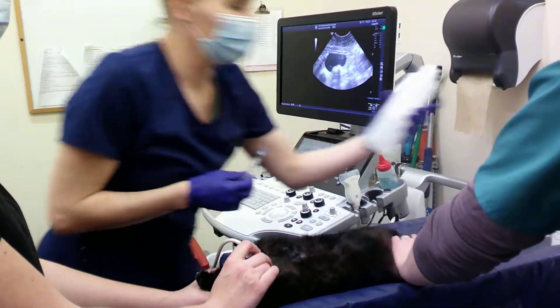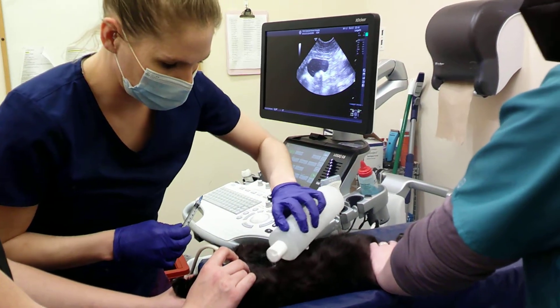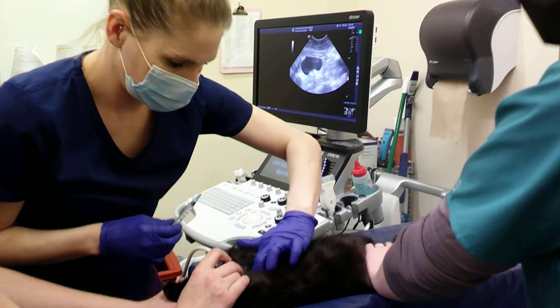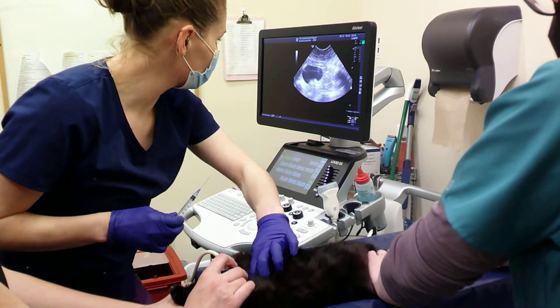22? So we're going to go ahead and sterilize the site with alcohol. And we're going to be doing a cystocentesis on this feline patient. We found it with the ultrasound.